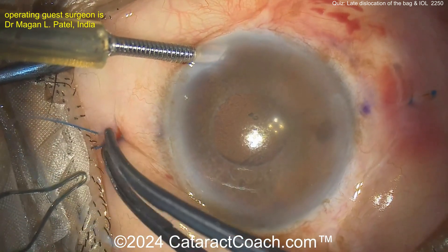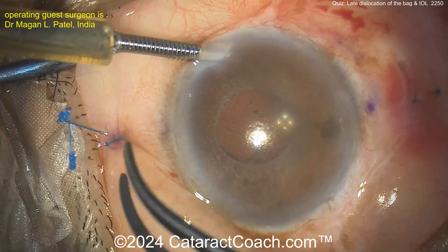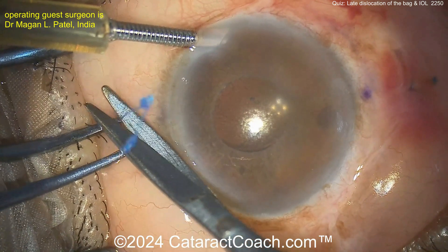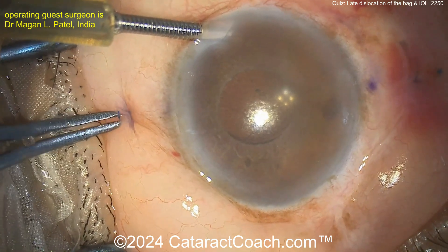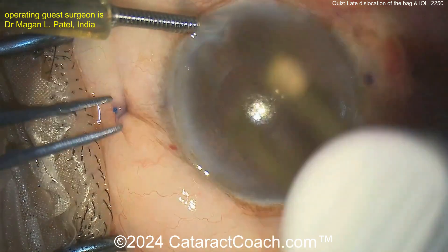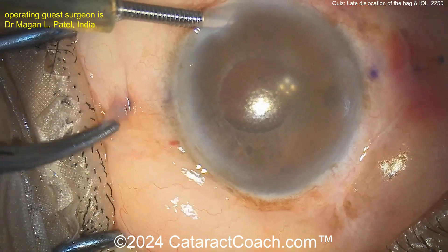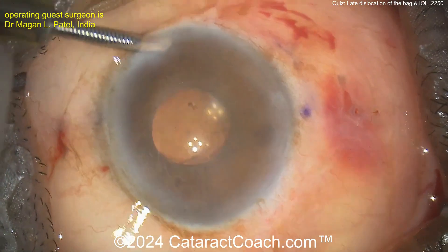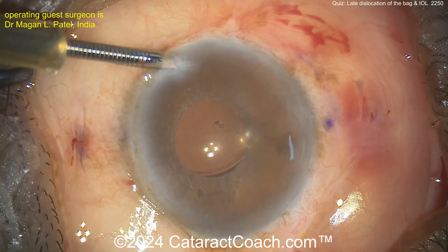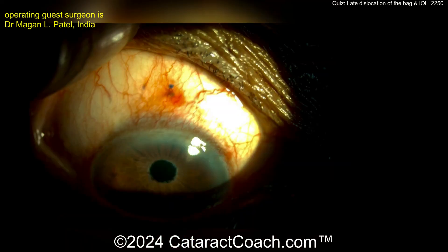The patient is probably not super young given that amount of pseudoexfoliation at the iris margin — we usually see this kind of pseudoexfoliation a little later in life. So if this can last 10 years, that's going to cover it for the patient's lifetime. Pulling that flange through, cutting it — don't let it fall in. Grab that little nubbin, a little bit of cautery, and push those nubbins into the sclera.